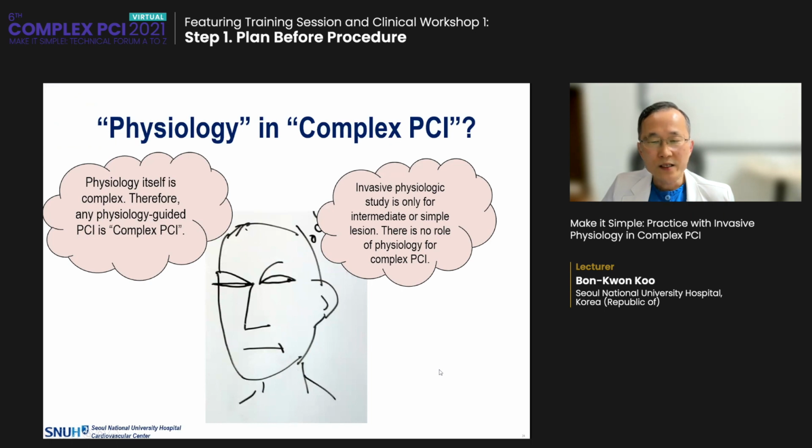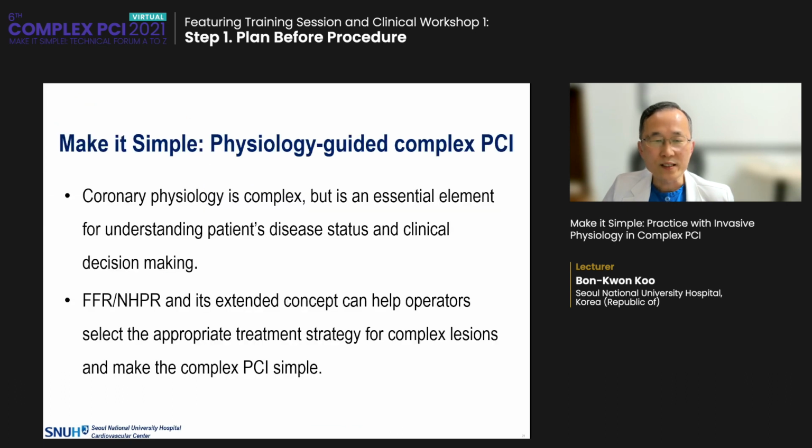In the beginning, you might have had rather skeptical thoughts about physiology in complex PCI, but I hope that now you agree with this conclusion that coronary physiology is an essential element for understanding the disease and clinical decision-making. Therefore, use of FFR or non-hyperemic pressure ratio can help operators select the appropriate treatment strategy and make complex PCI simple. Thank you very much for your kind attention.